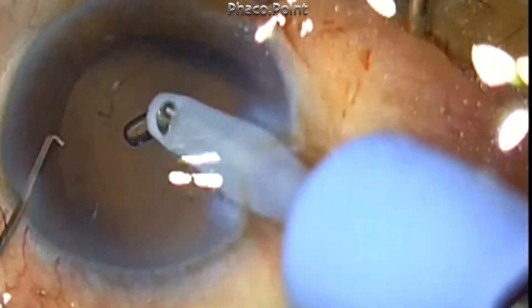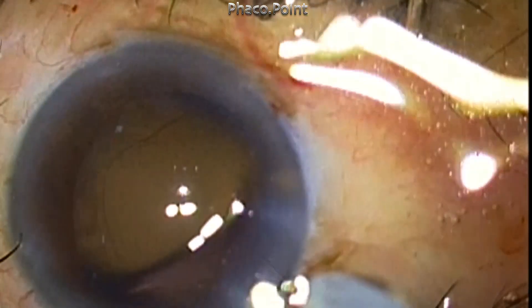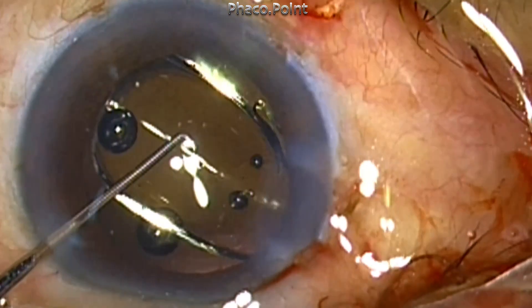At the end of this, you have completed the soft cataract phaco emulsification, which in many hands can be really challenging to perform because of the cheese wiring and because these lenses tend to form craters. Finally, the IOL is implanted.